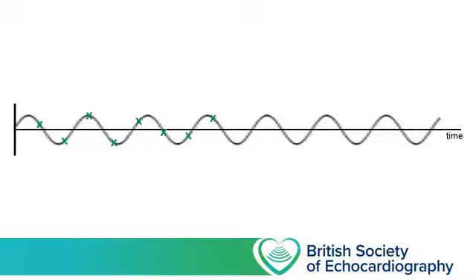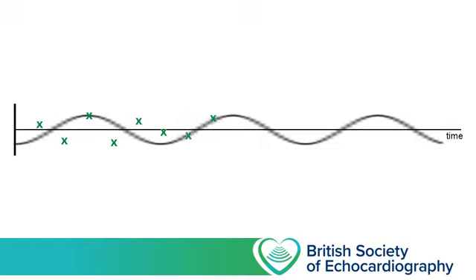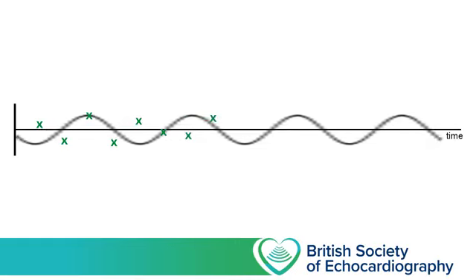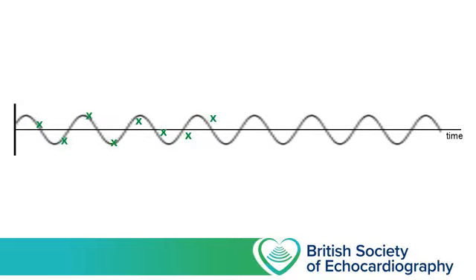Is it possible that there could be another wave with a longer wavelength and shorter frequency that could have produced the same distribution of samples? Well, in this case the answer is no. The frequency with which we've sampled our wave means that we have just over 2 sample points per period, and as long as on average we have greater than 2 sample points per period, it's not possible to confuse our wave with one of a lower frequency.